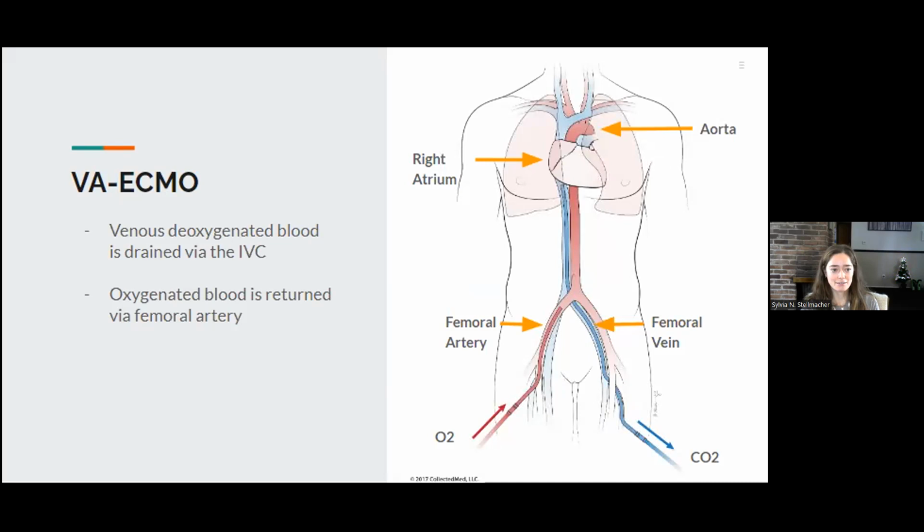And this was certainly something unusual to me when I first was reviewing how the ECMO circuit works, because blood is flowing in the reverse of our typical fashion of our native heart function. The oxygenated blood is flowing up through the aorta towards the heart. And we'll review some complications that can happen with this. But your ECMO circuit is providing that oxygenated blood to both the lower extremities and the upper extremities and brain and heart in this fashion.